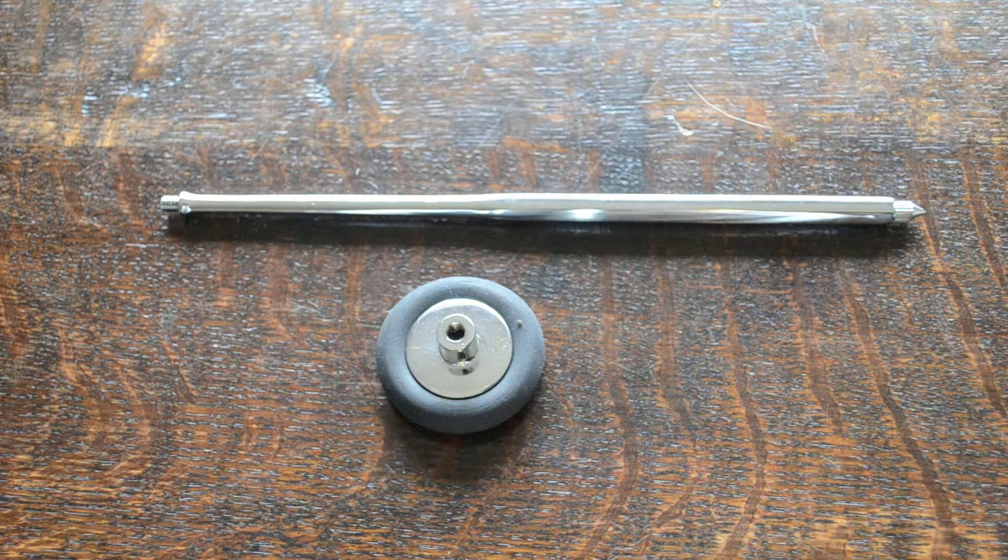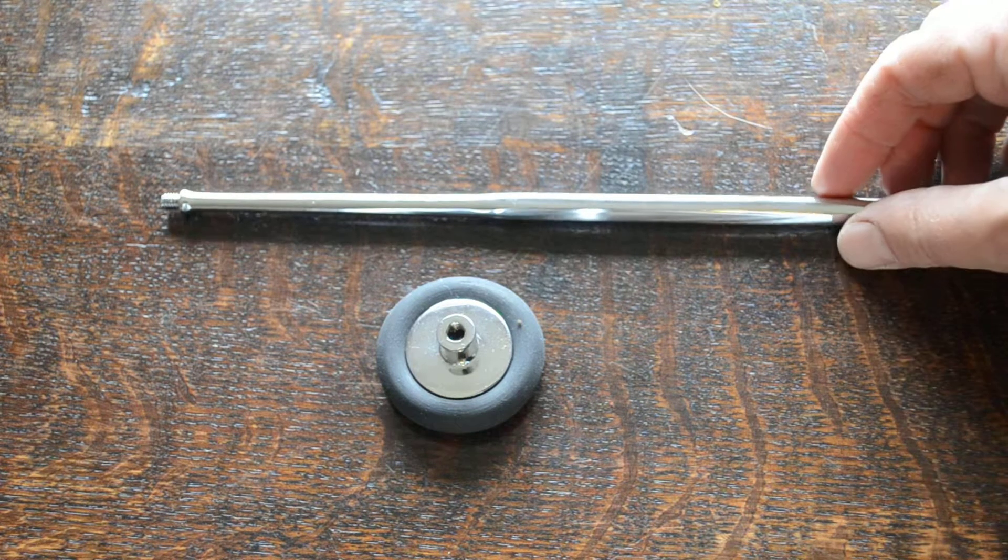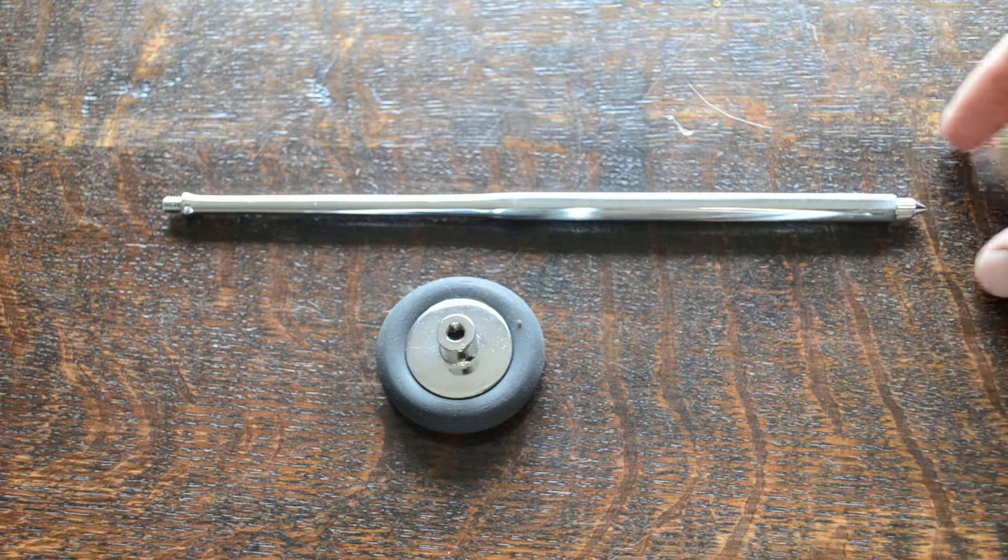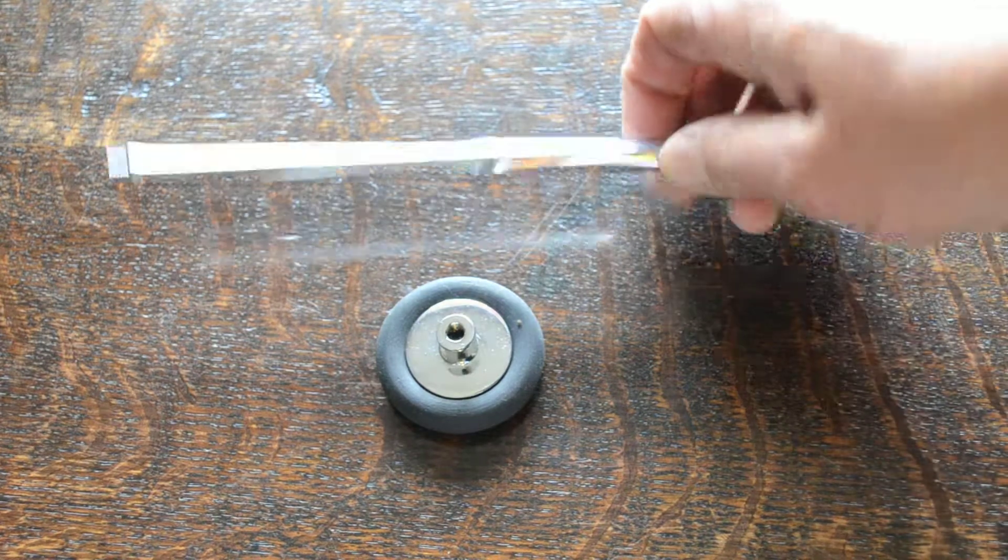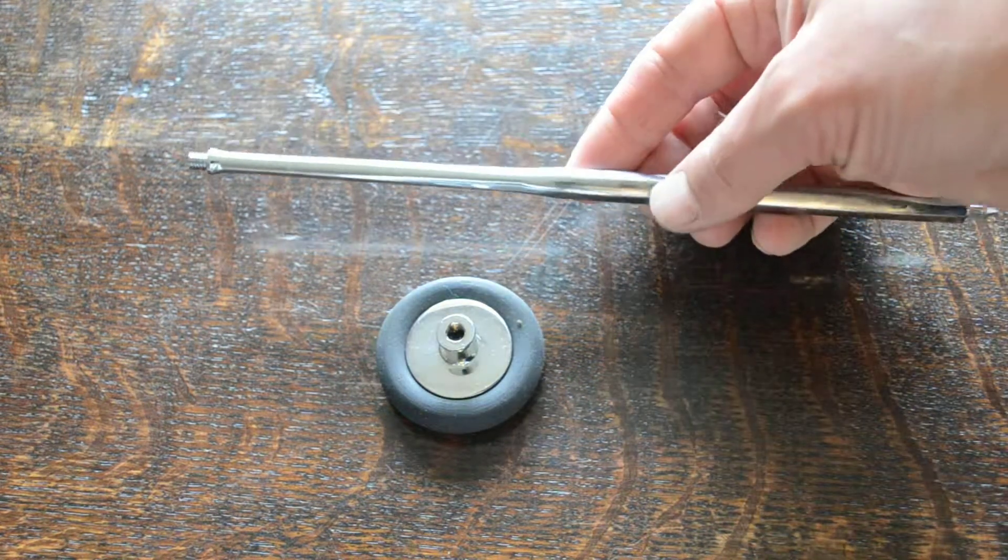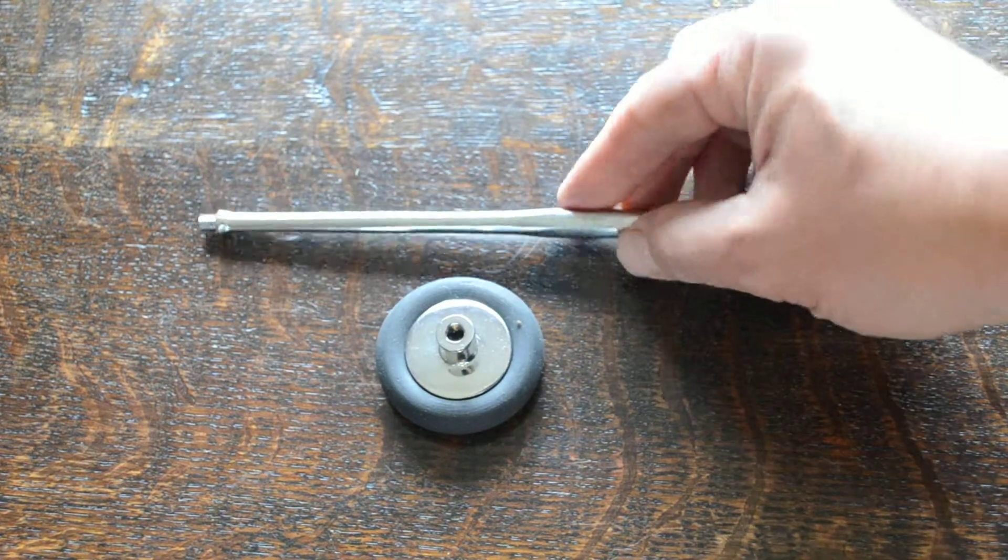This is a nice surgical steel handled unit, approximately 26 to 27 centimeters in length. Really good weight in the surgical steel handle.